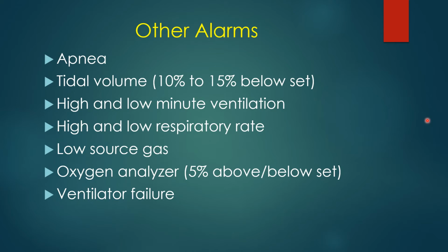Our older ventilators would alarm and just keep alarming until you went and assessed the problem. Today's ventilators, though, we set an apnea backup. So we set the settings that we want to ventilate the patient with in the apnea backup settings. And if the patient goes apneic for 20 seconds, it goes into apnea ventilation, and the patient is ventilated by the ventilator.